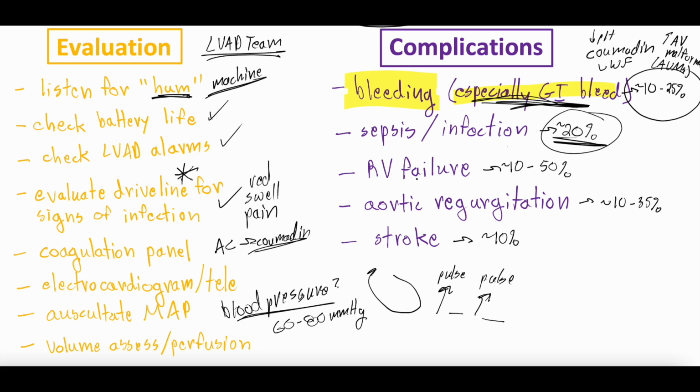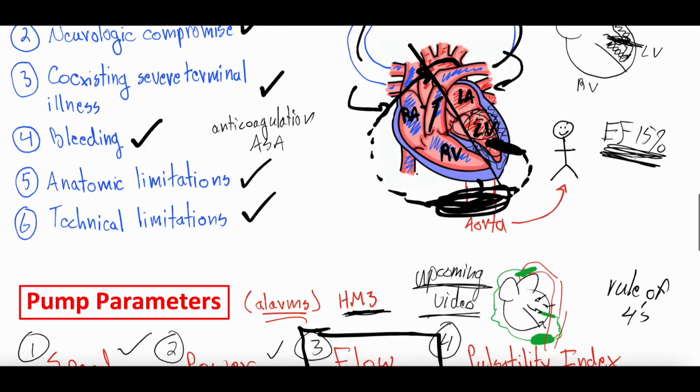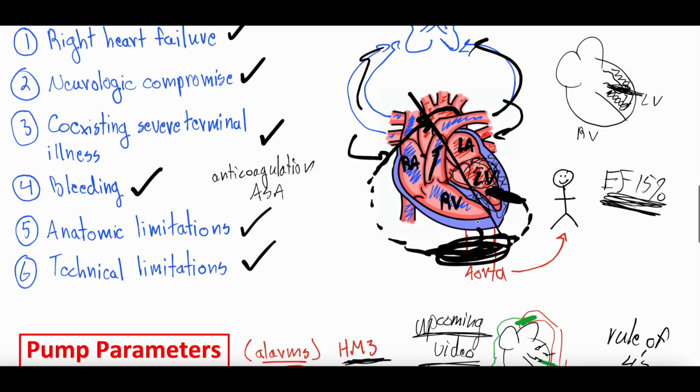And why is that? Well, it's because of what we talked about. Let's go see if we got a good picture. Right side of the heart, left side of the heart. Right ventricle, this would be RV failure. That LVAD is sucking blood out of their left ventricle and shooting it around their body.